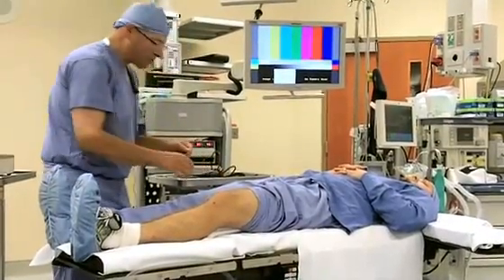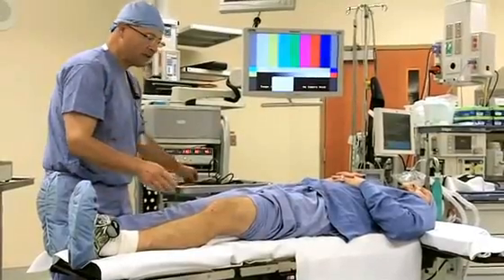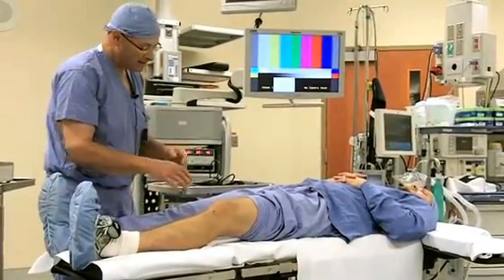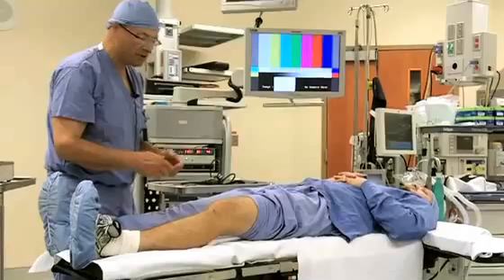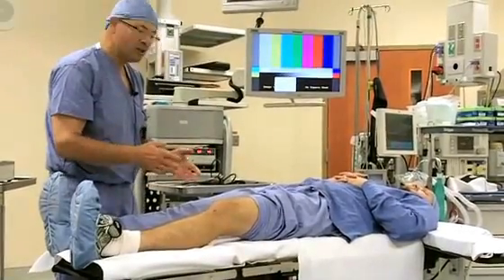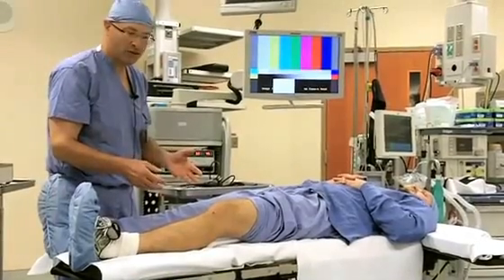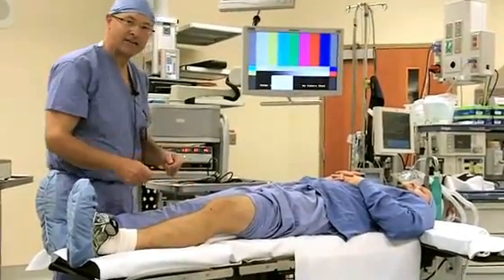The first step in arthroscopy is diagnosis. You have to find out what the problem is. We look at the whole knee joint, the patella, the kneecap area in both sides of the knee. We look at the ligaments, we look at the cartilages or meniscus. In this patient we're going to see the video of today. There's a medial meniscus tear or a tear of the cartilage on the inside of the knee.